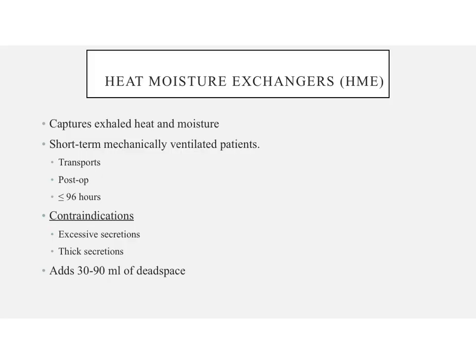Heat moisture exchangers, also known as HMEs, are passive humidifiers. So if you can remember that these are passive, then you'll know the rest of our humidification devices are active. Heat moisture exchangers are also known as the artificial nose. That's because they capture exhaled heat and moisture from the patient and recycle it with every inspiration and expiration. So it's recycling their own heat and humidity to keep the air that they are breathing heated and humidified.